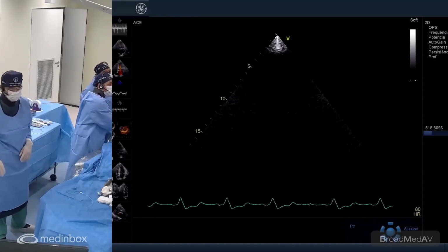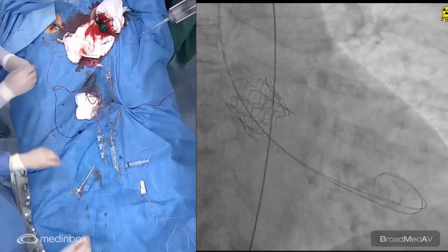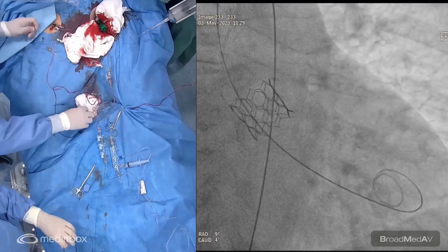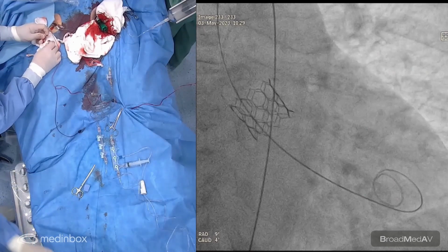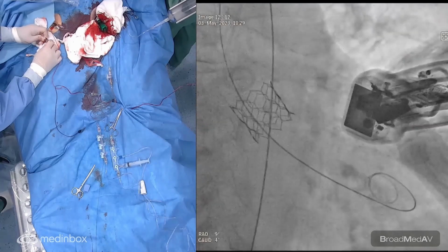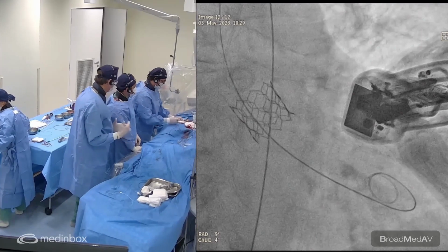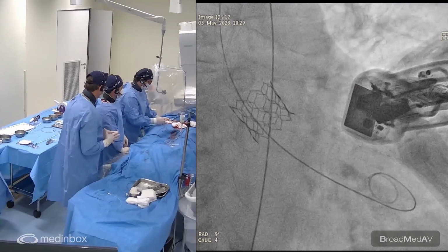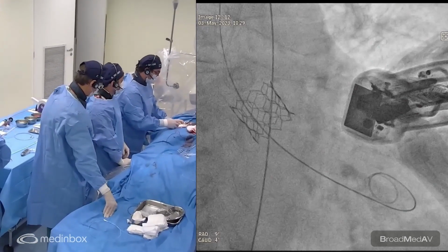Okay, can you bring the angio on the screen now, please? We are not questioning what Andrea just saw, but just to know how the prosthesis adapts to the anatomy. Is there any rule about the gradient? What is the minimal gradient that you accept not to post dilate?